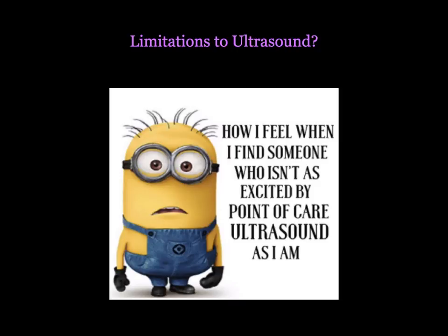Patients are in a lot of abdominal pain. Perhaps wait until they've received a dose of pain medication, whether it's Toradol for kidney stones or morphine or Dilaudid if you suspect something such as a small bowel obstruction or appendicitis. Give them some pain medication before you ultrasound them.